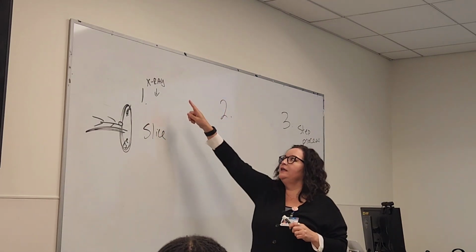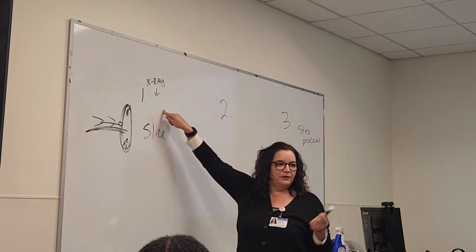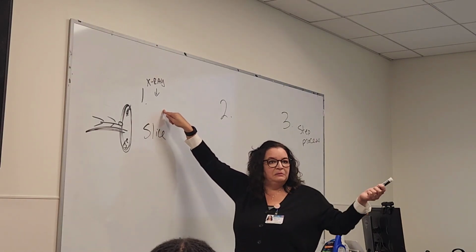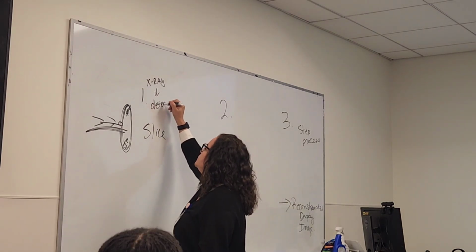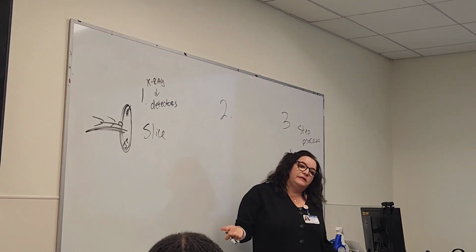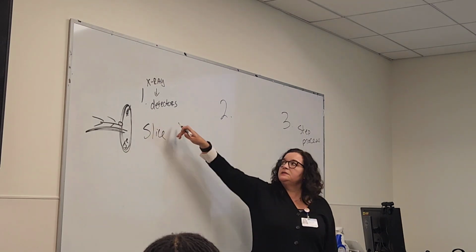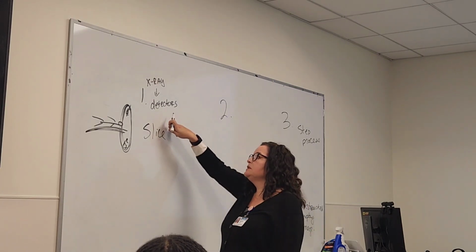You got it. So the X-rays always have to go to the image receptor. If not, you're doing therapy. You're not capturing an image. You're just emitting X-rays. Here, they're called detectors. They're not called imaging plates. They're called detectors. So the X-ray needs to make contact with the detectors. Okay? What is this process called?